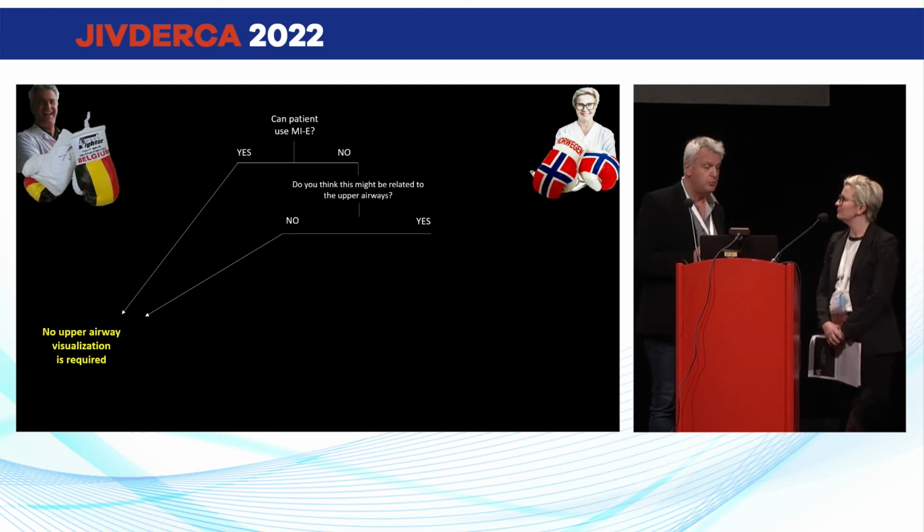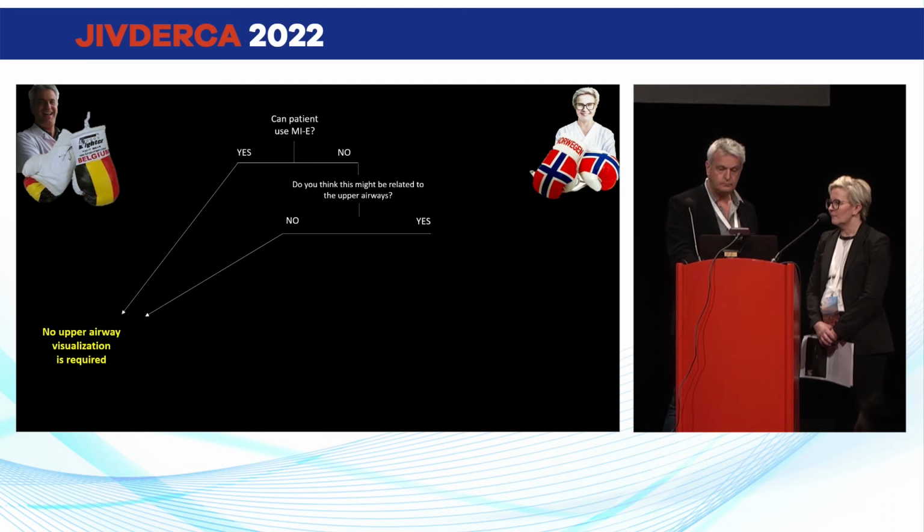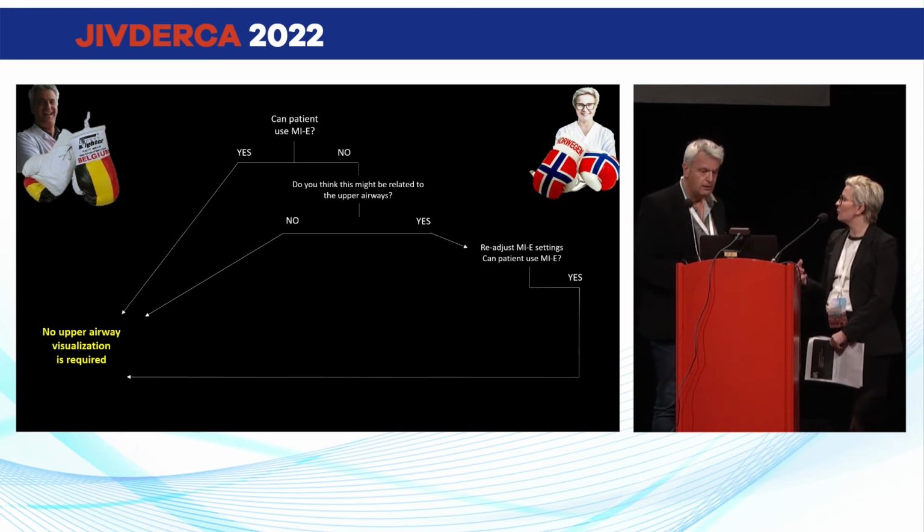But if the patient cannot use MIE, tell me if I'm wrong. If the answer is no, then the question is, do you think that this might be related to the upper airways? Again, two possibilities for a response. No upper airway visualization required, or possibly yes. Okay, do you agree with that? Yes. Okay.